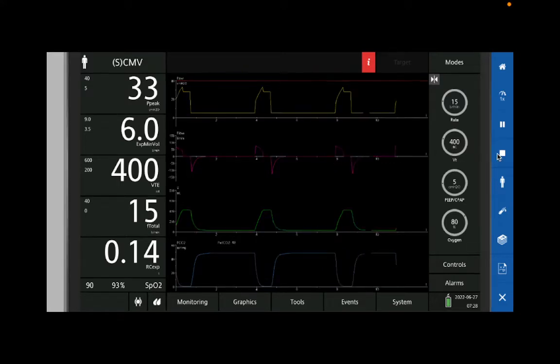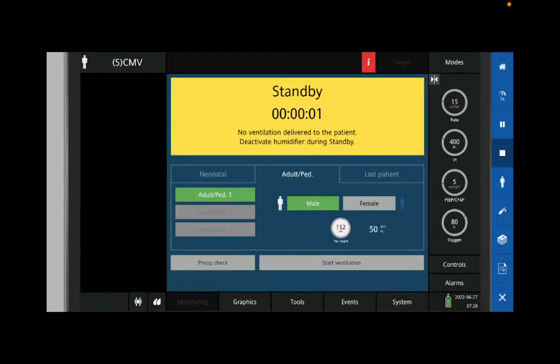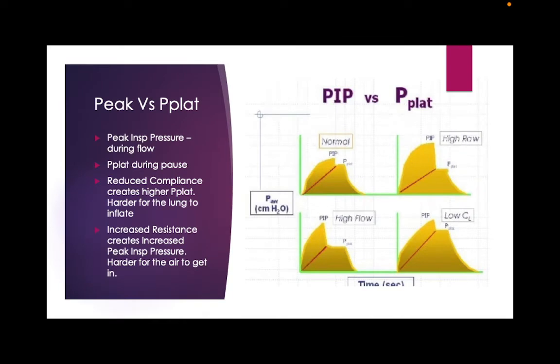Does that make sense? So anytime you're taking care of a patient and their peak pressure is high, what should you do? How can you impress your consultant? You can check a plateau. So for our machines, you've got the 4 knobs on the bottom, and then there's 3 buttons, maybe 4, beside the knobs, okay?